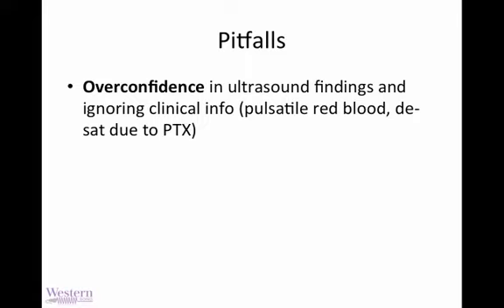So please, as best as you can, try to be very humble in your findings and recognize this is a new skill for you, taking in multiple data points while performing a complex set of interactions with needles and Seldinger technique in sedated or critically ill patients. A little bit of humility up front will go a long way. We often see a spike in complications for early users of ultrasound guided access because they start ignoring their basic senses regarding where their needle might be or where they are in the neck.